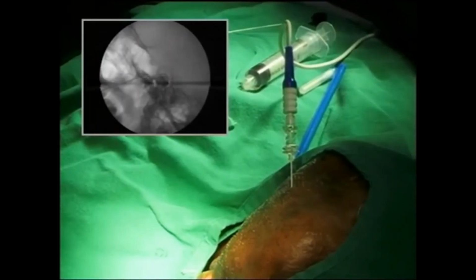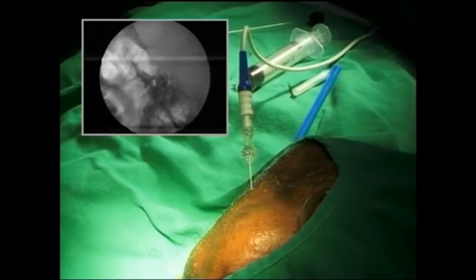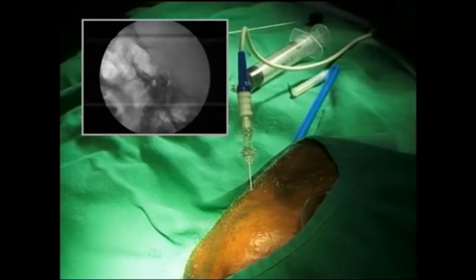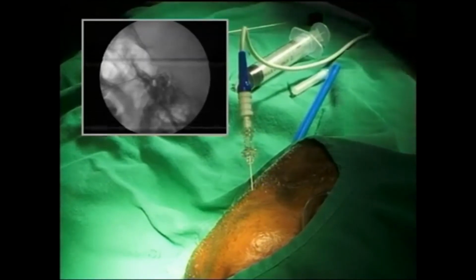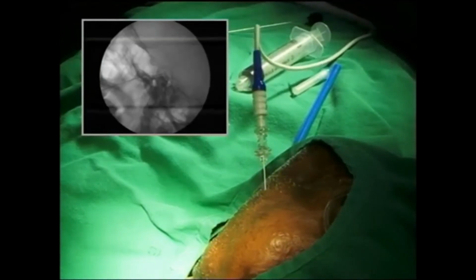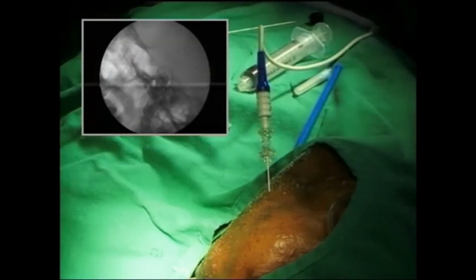Okay. So I probably was about 5 millimeters deeper than this. At that point, I got a bit of CSF. So probably the dural sleeve itself is a little bit lower. So that's fine. I'm okay because I'm going to do only an RF ablation. I'm not going to use neurolytic. So there's no possibility of it going into the CSF and doing a total spinal or something like that. Okay, so we'll do sensory stimulation now.